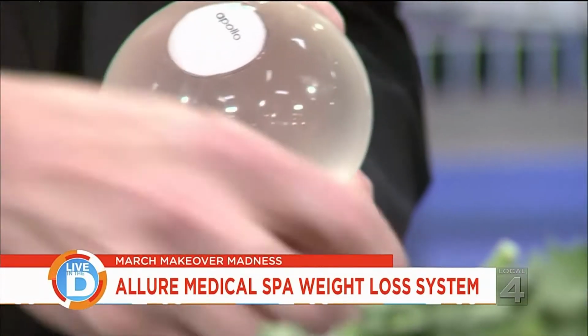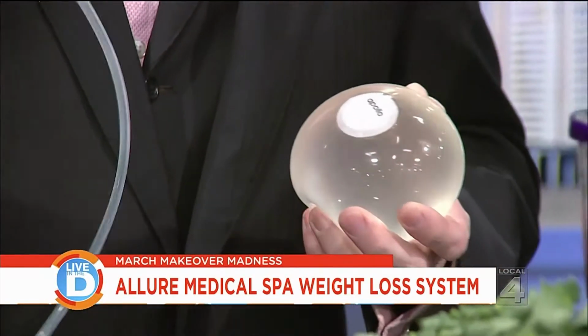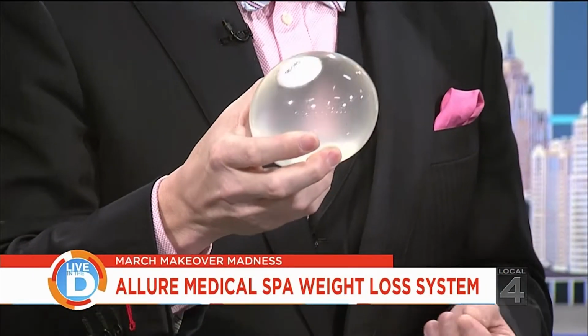We start with a deflated product. So it starts out like this. That's what it looks like when it goes in? Exactly. It goes down the mouth. But you're sleeping, so don't worry about it. You won't ever see it. So we start with this down. It goes down into the stomach. Once it's in place, we then inflate it, and then this sits inside the stomach.